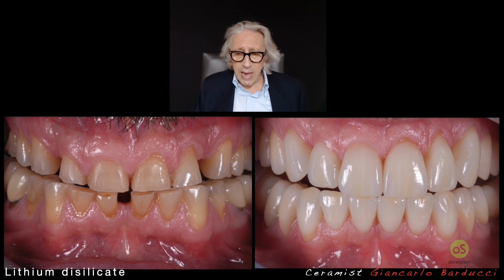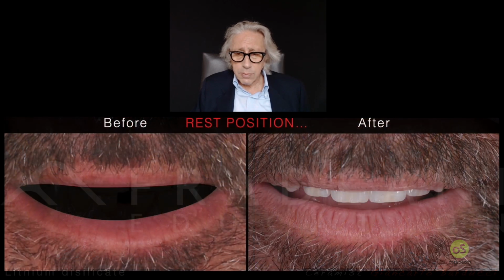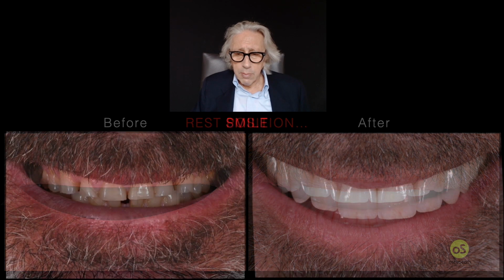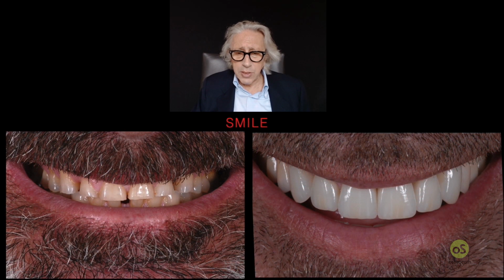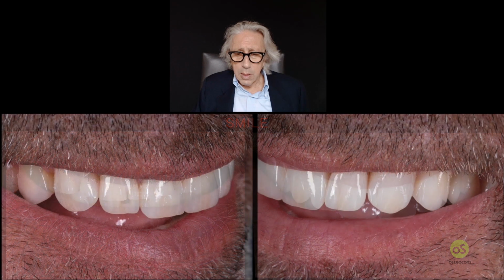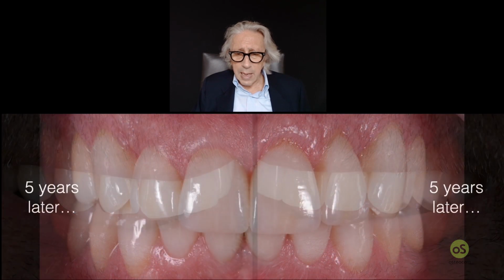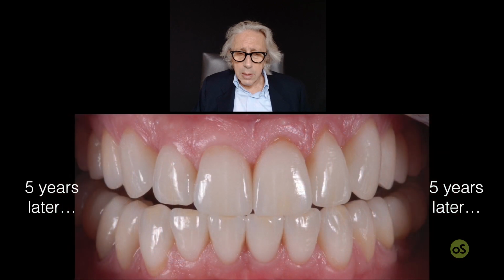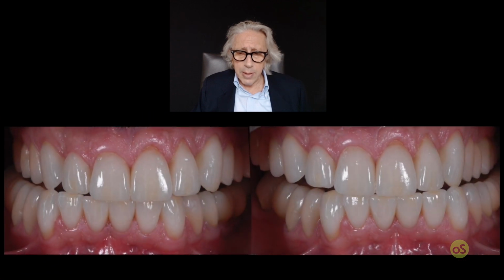And then the final outcome in function: before and after at the rest position, before and after on the smile of the patient, lateral smile, lateral view. 5 years later, the recession is still there, of course. He hasn't had any kind of surgery yet. In protrusion, everything works well. All the soft tissues are getting better and better.